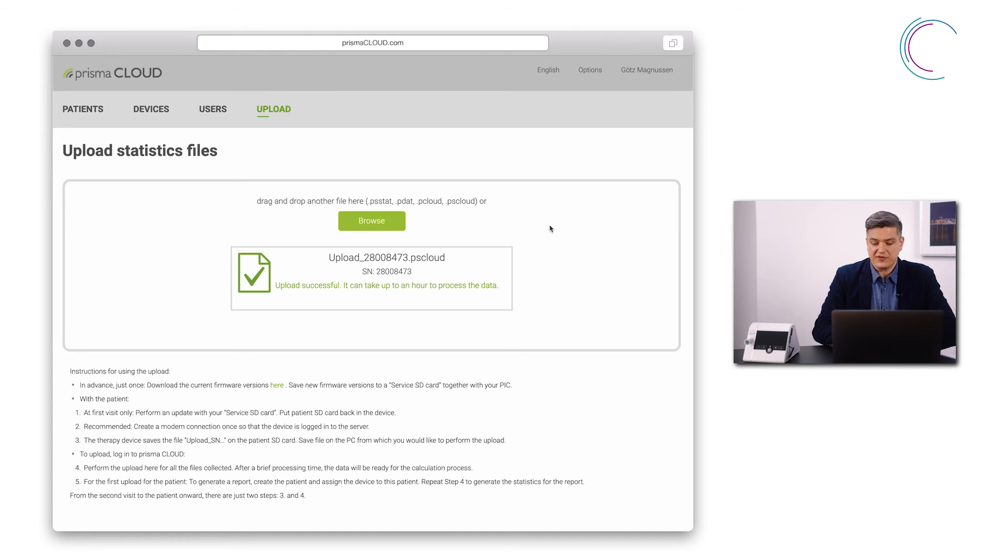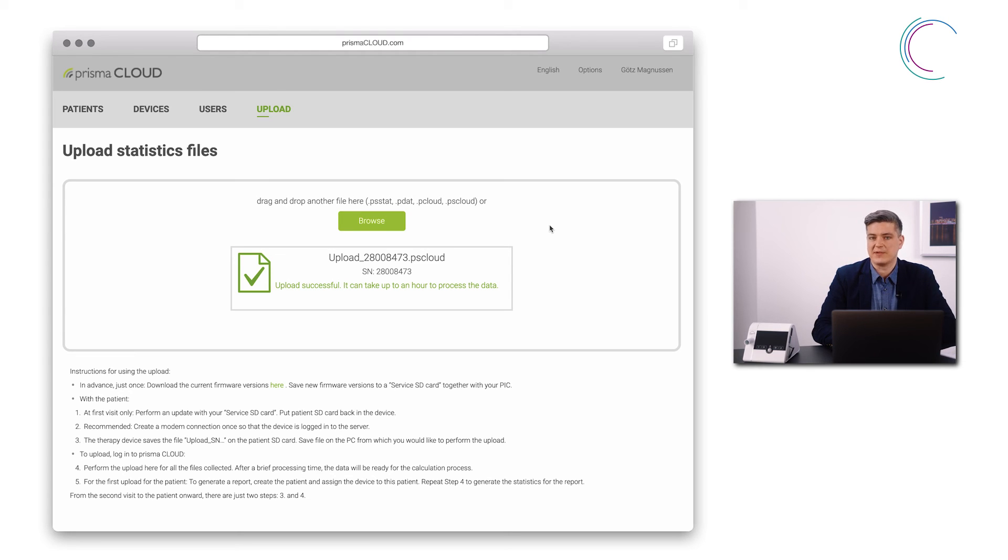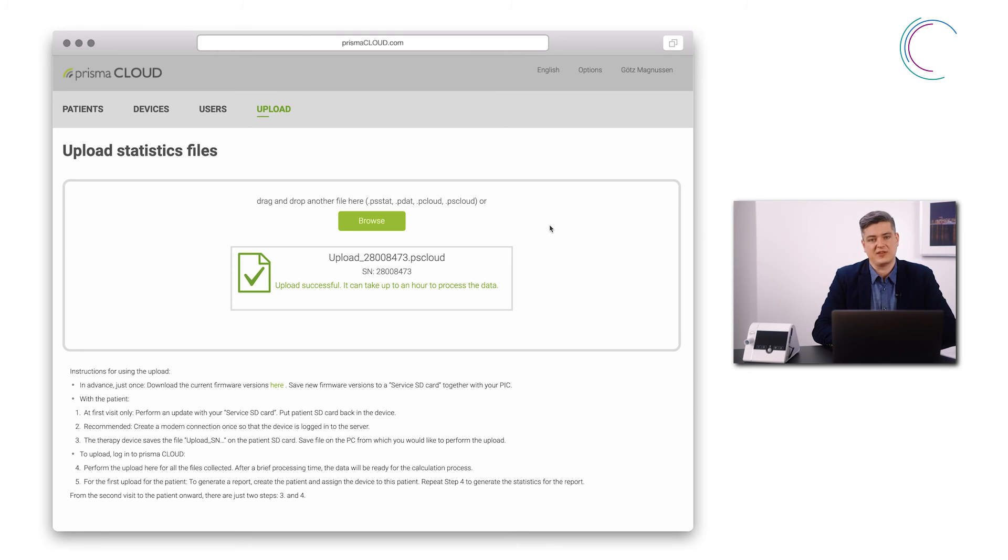If this serial number is already associated with a patient, the data will automatically show up next to this patient. If not, you can proceed and start the association with the patient.